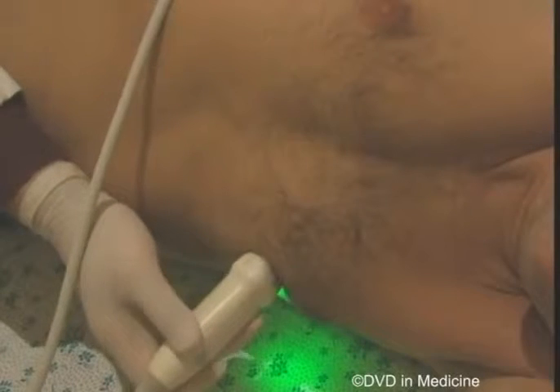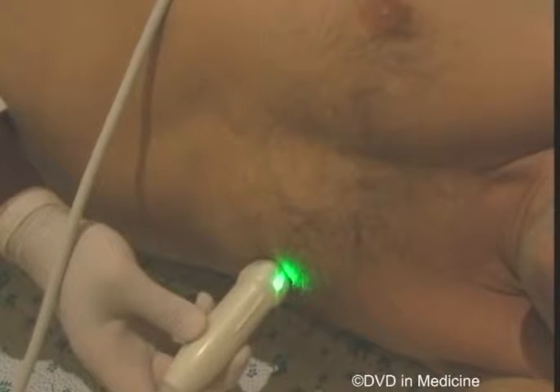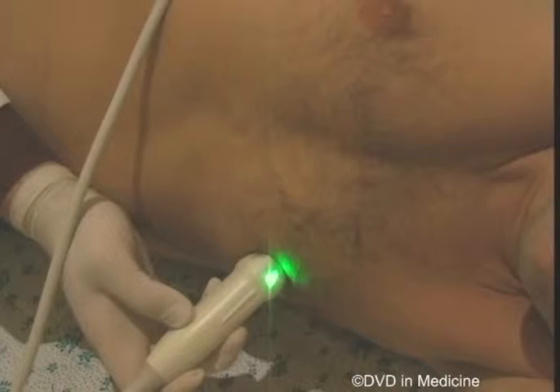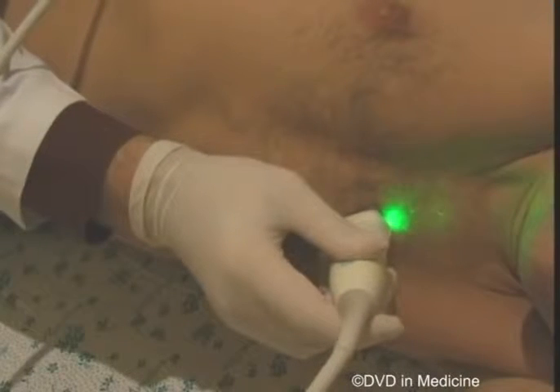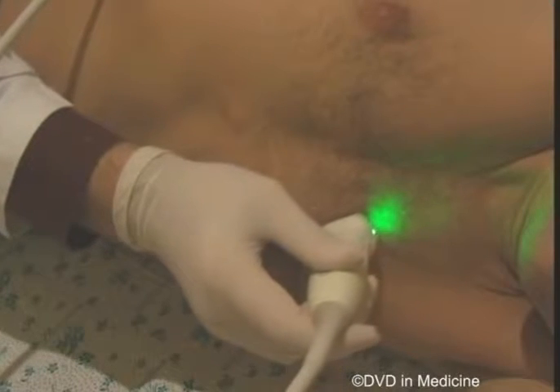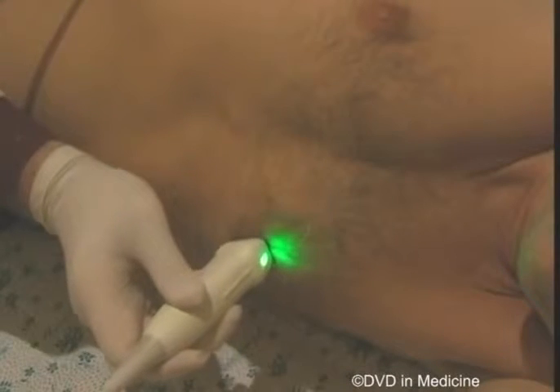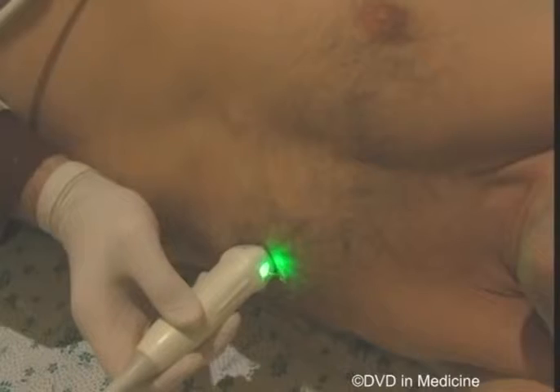From the apical four-chamber view, one should rotate the transducer about 120 degrees counterclockwise in order to obtain an apical long-axis view of the left ventricle, or the so-called three-chamber view. An alternative method of obtaining this image is to initially obtain a parasternal long-axis view of the left ventricle. Then one must move the transducer onto the apex of the heart without changing its orientation.